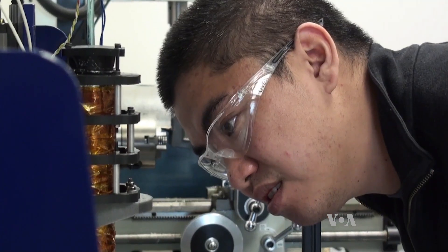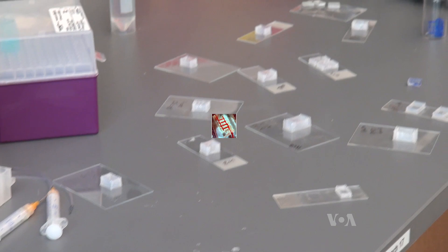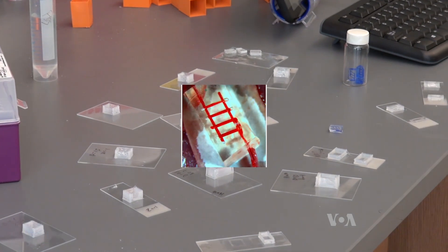This 3D printer is using a sugar solution to make molds, which can be used to make silicone veins and arteries. The researchers successfully implanted these artificial blood vessels in a rat last year.